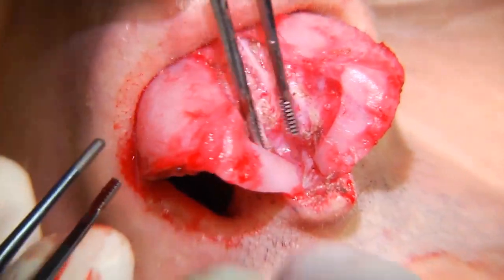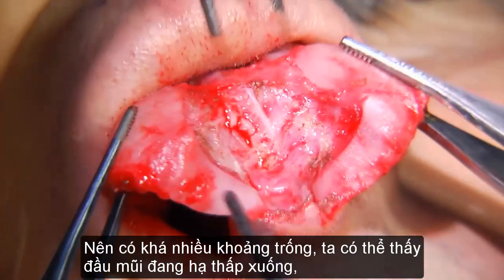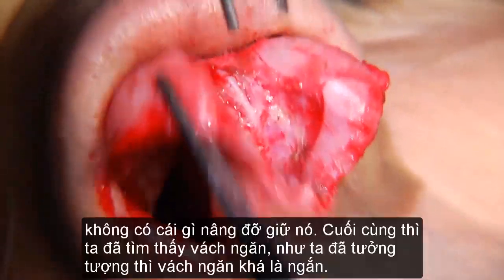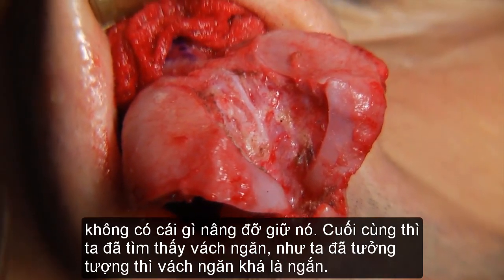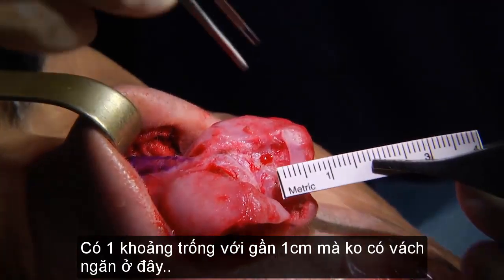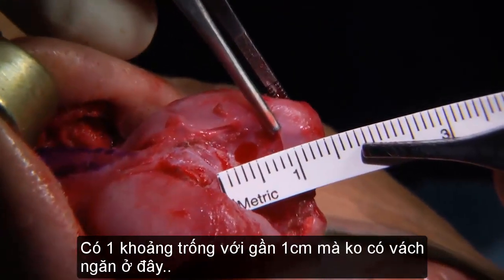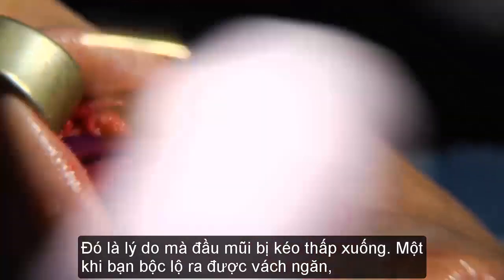Okay, so I see. There's a lot of space. You see, it's almost as if somebody, see why this tip was falling, there's nothing holding it. Finally, we found the septum. As I had imagined, this septum was short. There is actually a space, like a full centimeter here, in which there's no septum. So this thing was falling down.